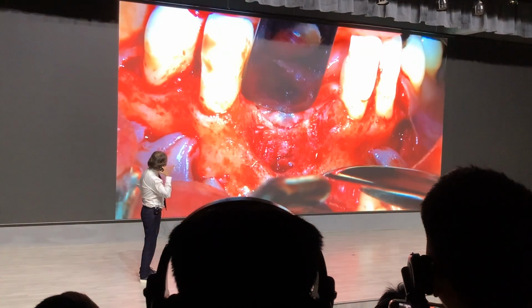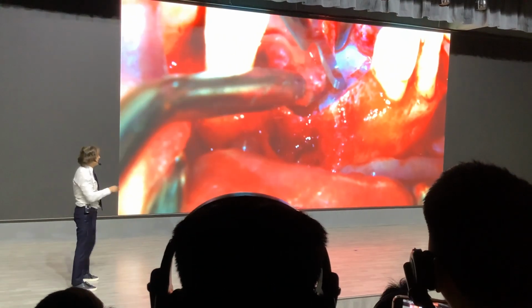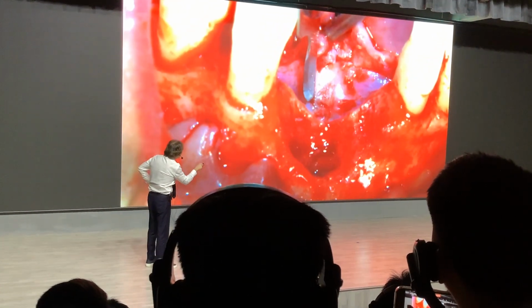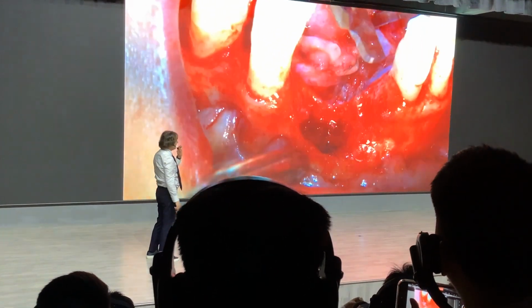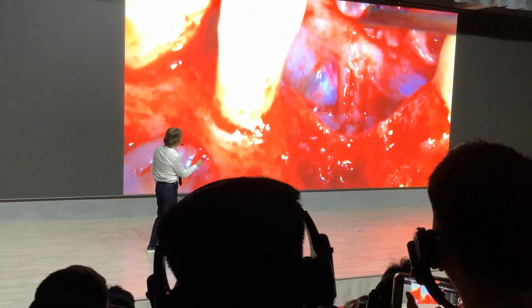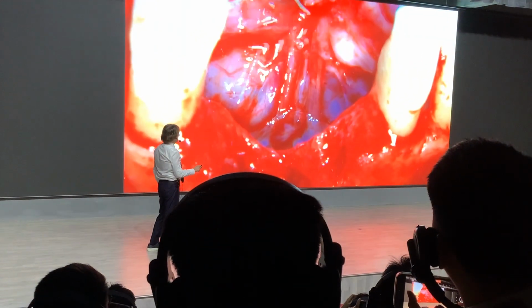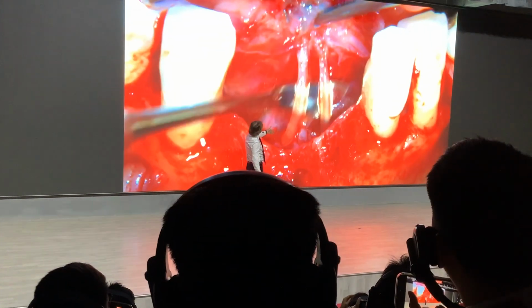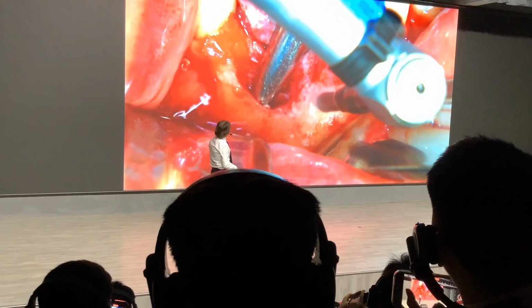There was an implant here, remember, I showed it in the morning. Now, with the back end of the blade, one artery is there. Next artery is going to be here, behind, between the periosteum and the dense connective tissue. Stretch up one, stretch up the other one, stretch up here, and now I like to play with this. See that? Just play a little bit with this.